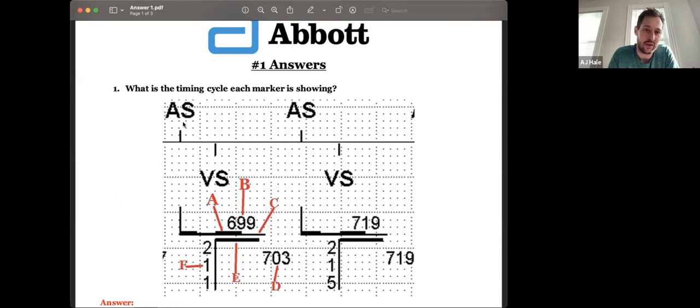So you have your atrial sense channel here. Your ventricular sense is marked here. This is going to be your marker channel. And then these are what's called, if you customize it, full markers. I always recommend using this because it gives you all the information that the device is seeing and can kind of help you interpret timing. So A-sense, V-sense, A-sense, V-sense going down the line.